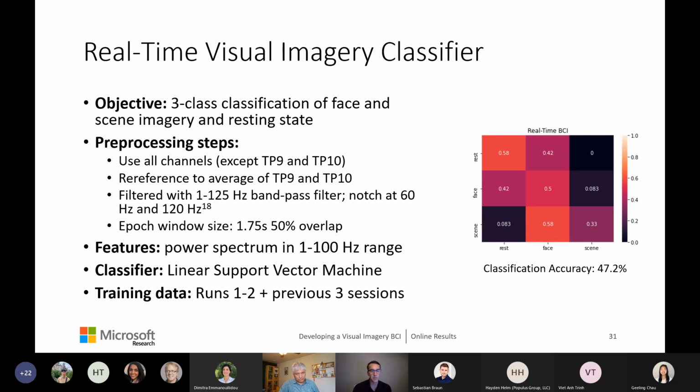They were using common spatial patterns. So definitely there could be some more work on this side to see if using some different types of features could help improve our accuracy some more. Right now, I'm just starting with something a little bit simpler, just frequency spectrums, and seeing how that worked. But great question. Thank you.